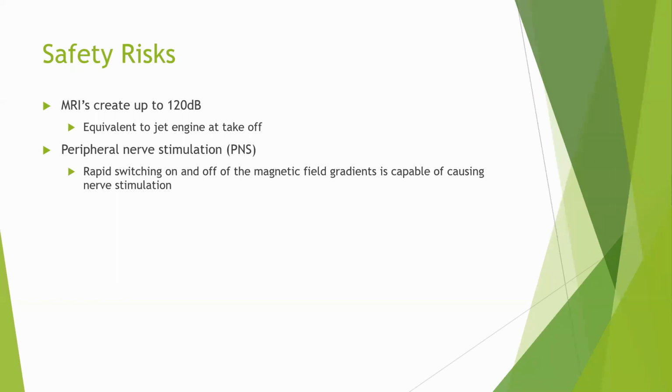It rotates because it takes scans like this, and that is really loud, right? Because you are inside the MR scan. That's the reason they give you headphones and music to hear. So you still hear the sound, but it's not that much.